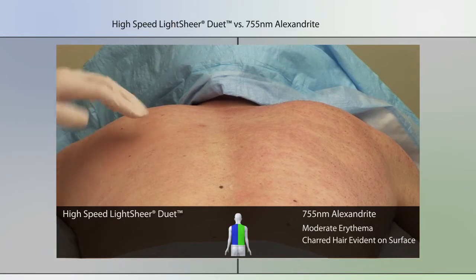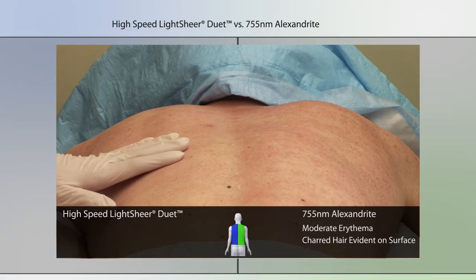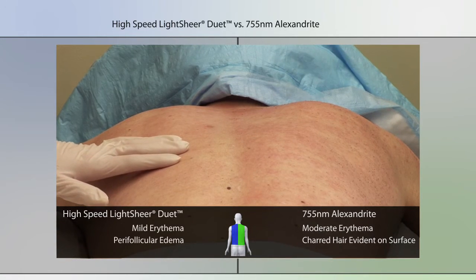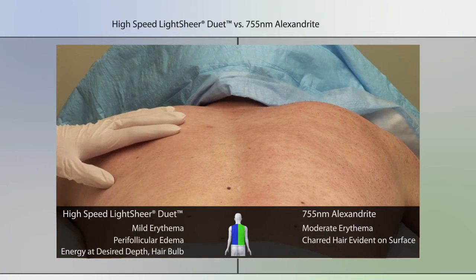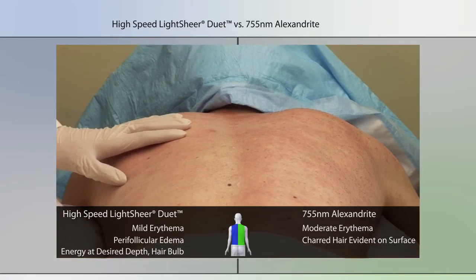If you take a look here, I would call this pretty minimal to mild erythema. There's a little bit of perifollicular edema, which to me indicates a pretty effective treatment, that the laser light energy hasn't been concentrated at the surface of the skin, but instead has been more effective where we want it to go, near the bulb.